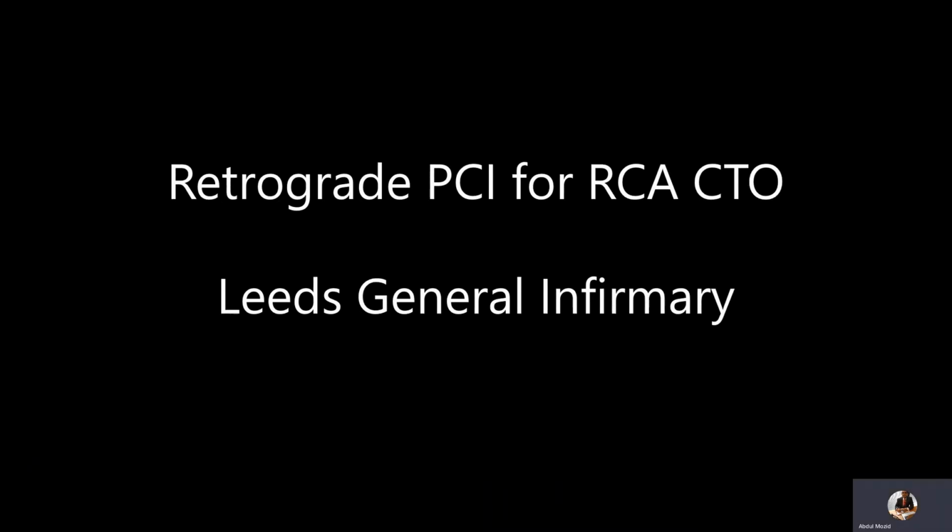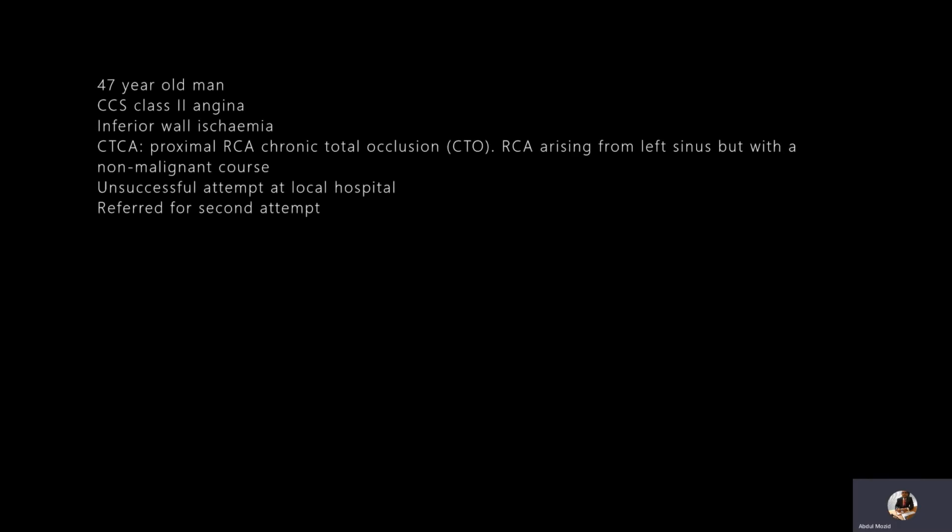Hi, and welcome to Complex Coronary Cases from the Leeds General Infirmary. This is a case of retrograde PCI for a right coronary artery chronic total occlusion. I am Dr. Abdul Mozid, and this is a case I proctored with Dr. Steve Lindsay, consultant cardiologist at the Bradford Royal Infirmary.